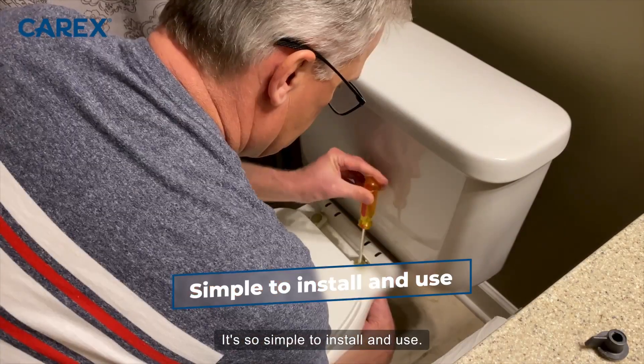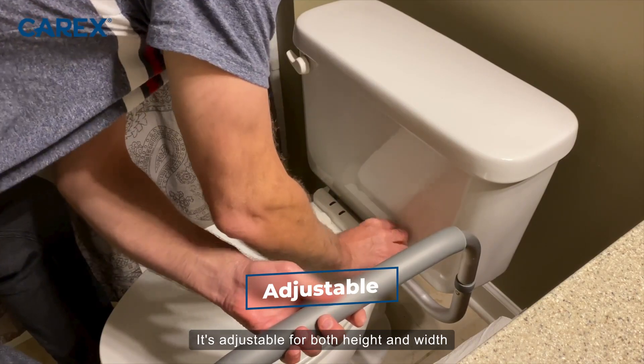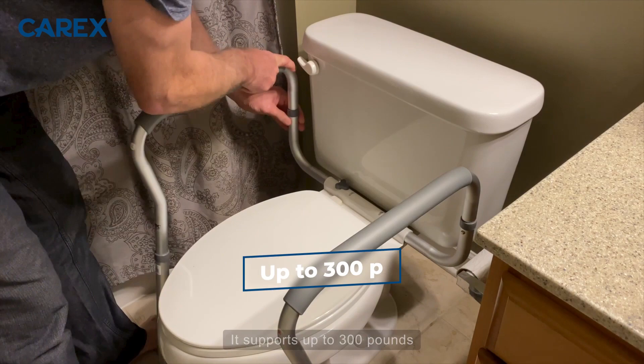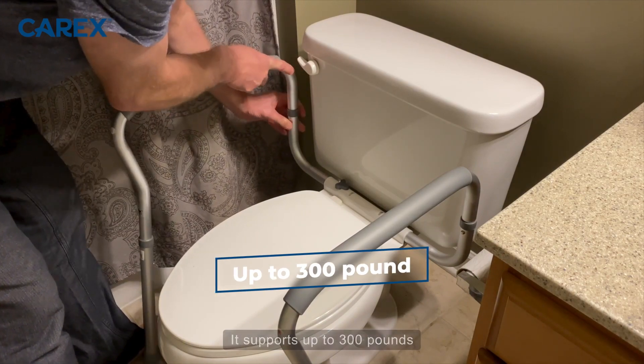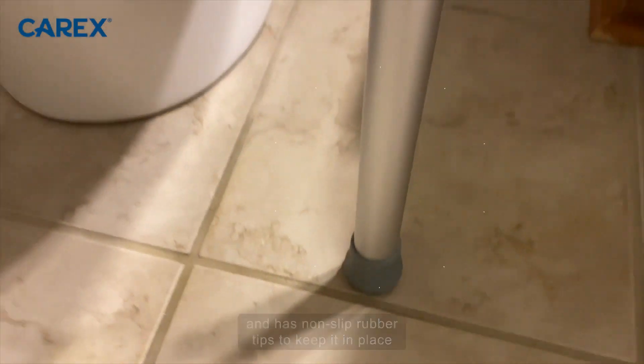It's so simple to install and use. It's adjustable for both height and width, and it fits just about any standard size toilet. It supports up to 300 pounds and has non-slip rubber tips to keep it in place and from falling.